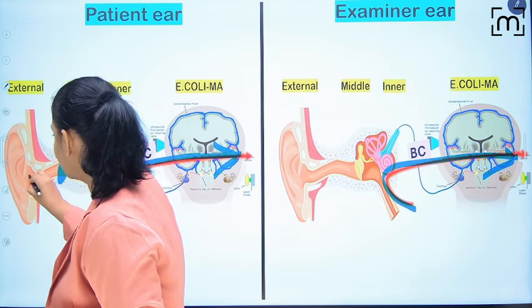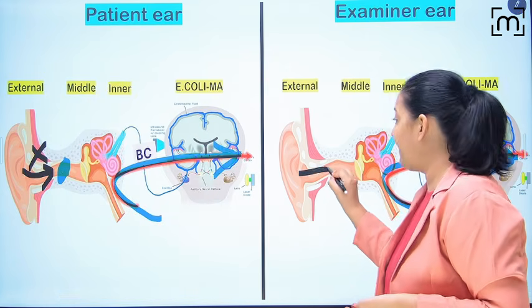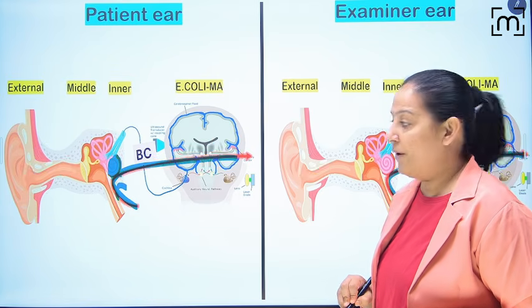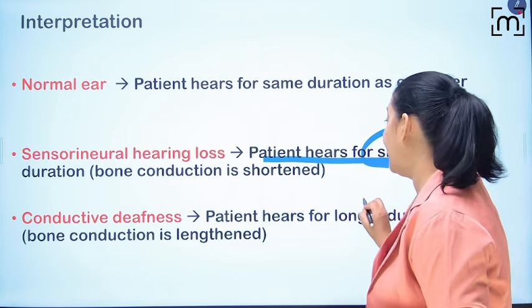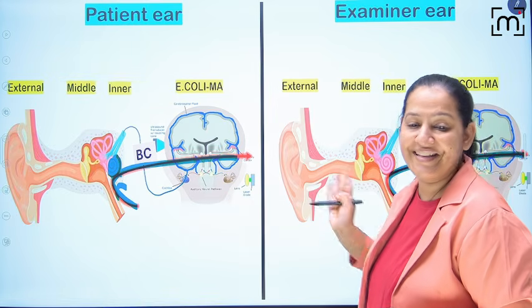Here background noise will not come because there is wax, a conductive defect. But here background noise will come. Here background noise will come. You are getting my point. So what I am saying is, the patient hears longer than the examiner.